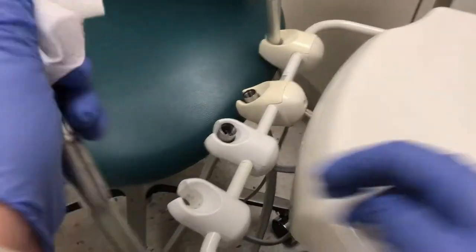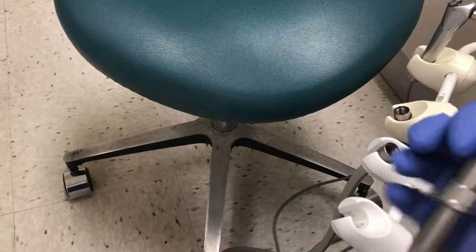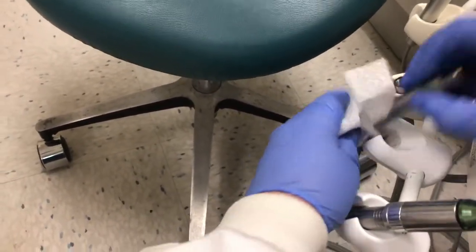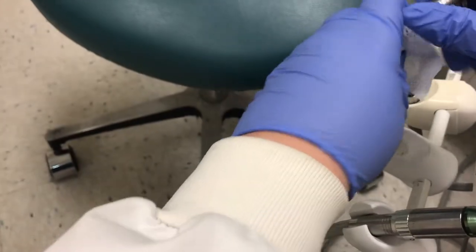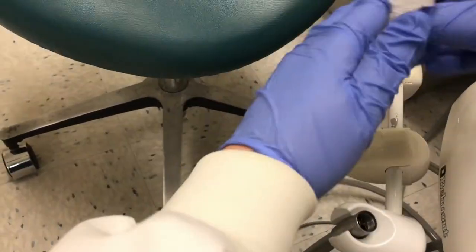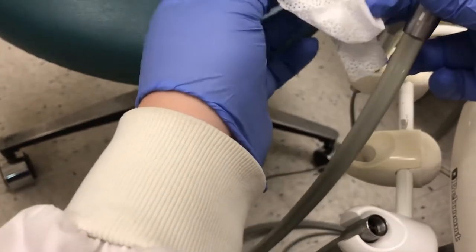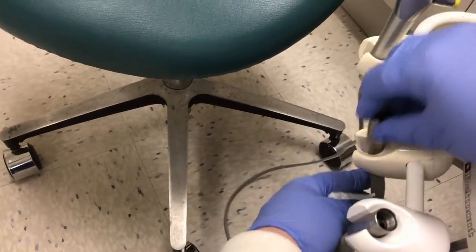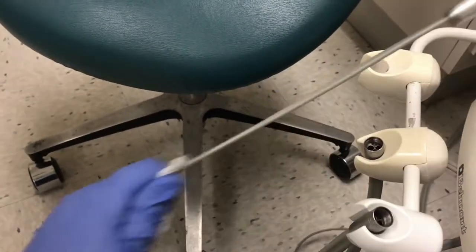Continue this procedure for every item in the operatory. It's important to remember that this first towelette is only cleaning the surface — it's technically not disinfecting. What we have to do after we clean all of these surfaces is to go back with a second pre-moistened towelette and re-wipe the same surfaces. The first towel cleans the surface of bio-burden and the second towel disinfects.